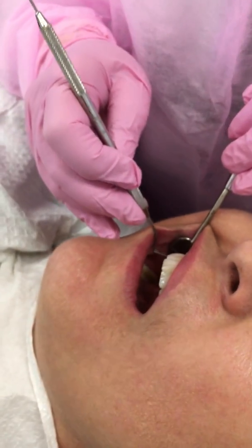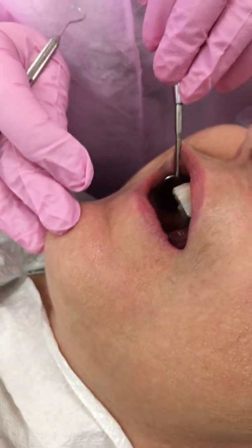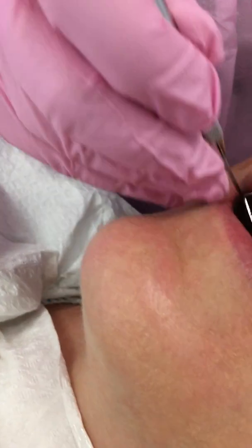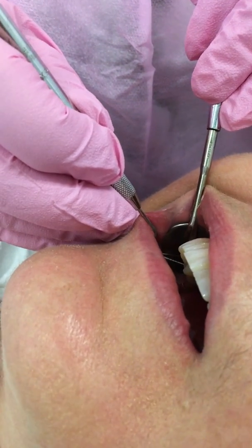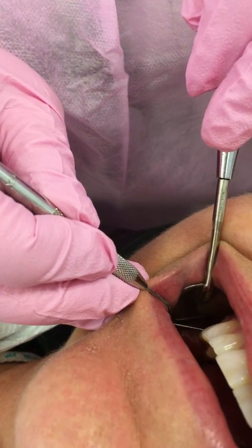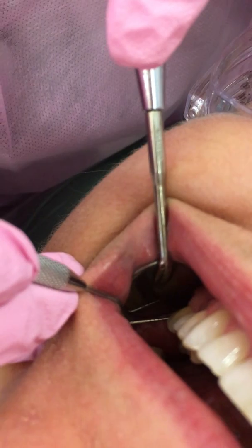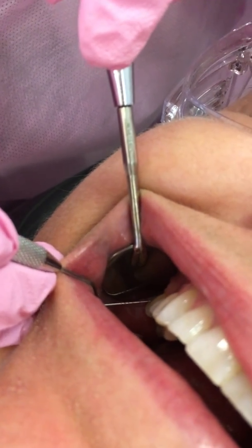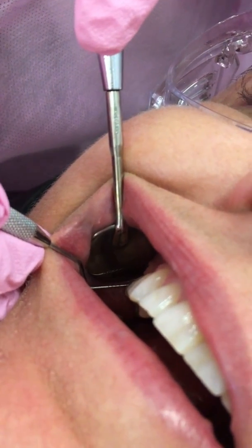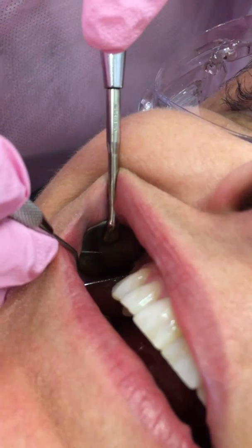In order to get in this most posterior, I'm going to take my mirror and go in and retract the lip, and I'm going to have her close slightly, and that releases the TMJ, and you're not going to be able to see very well, but I'm going to put my probe as distal as I can. Remember, we wanted to go past the line angles, right? Into what area? The col. And I am not going to remove my probe from the sulcus area as I walk it.